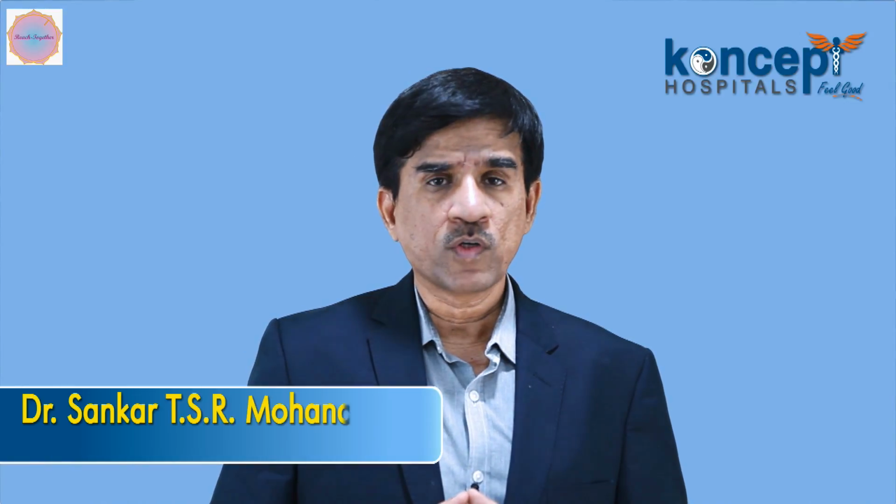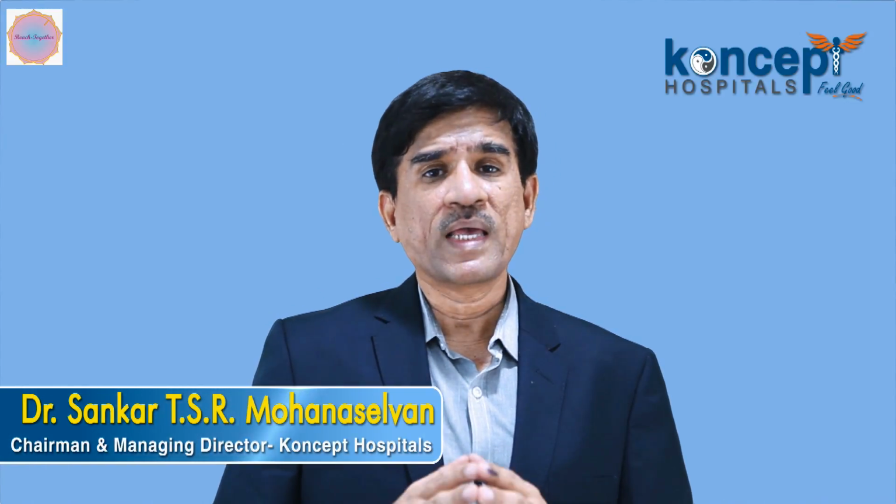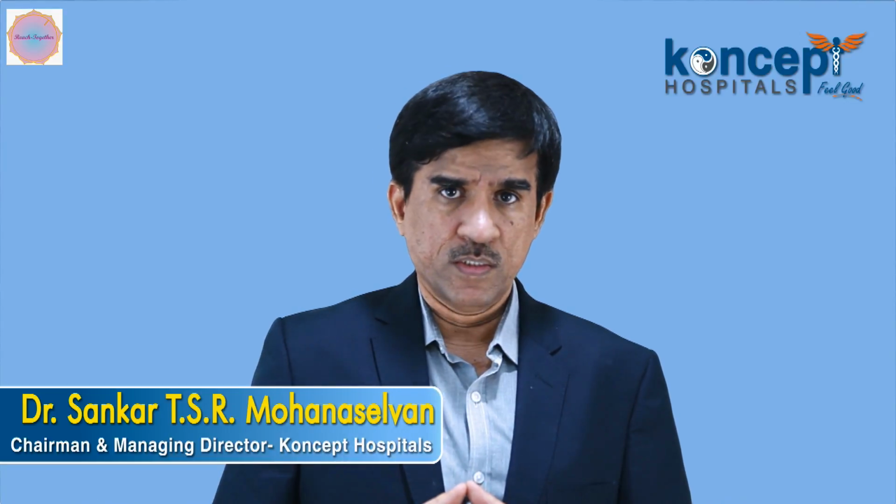And we also do what is called dry blood analysis, where a drop of blood is taken onto a slide and left for a few minutes until the blood dries. This dried picture of the blood drop gives us a lot of information about oxidative stress. The rotten part of the body, or what we call the damaged part of the body, can also be identified, and corrective measures can be initiated just by looking at the dry blood analysis. So live blood and dry blood analysis are novel methods of diagnosing disease without any major intervention. So it is safe and gives a lot of information. Give it a try.